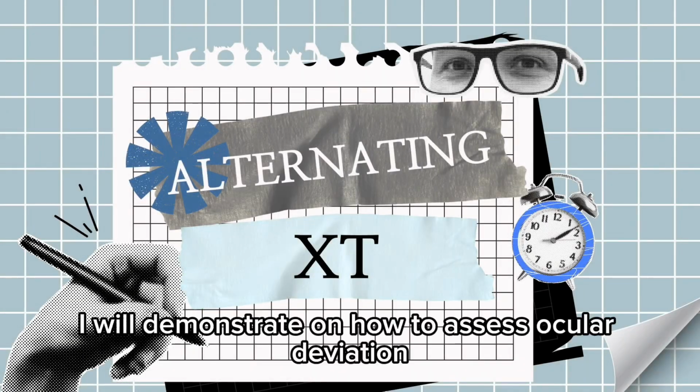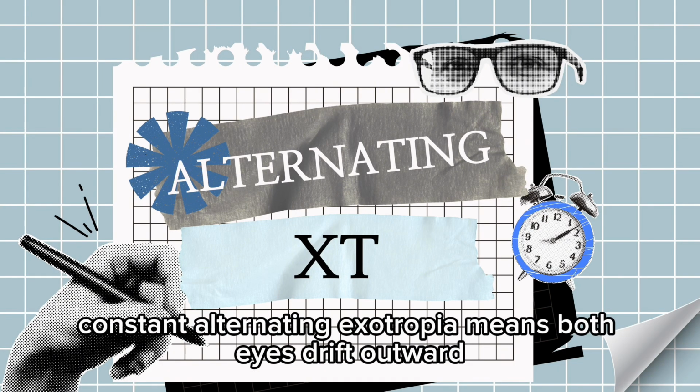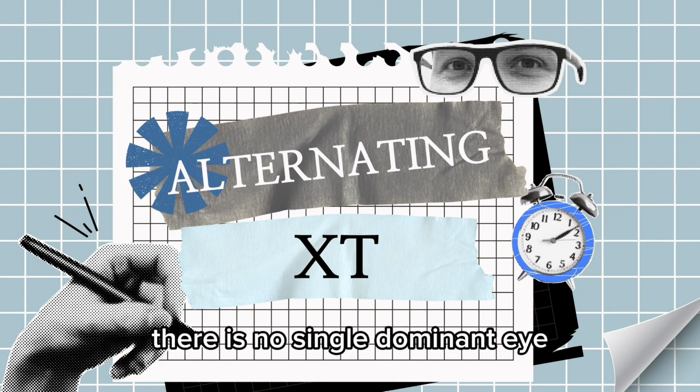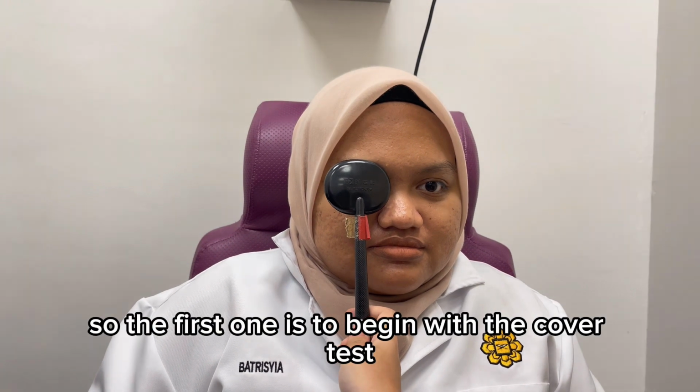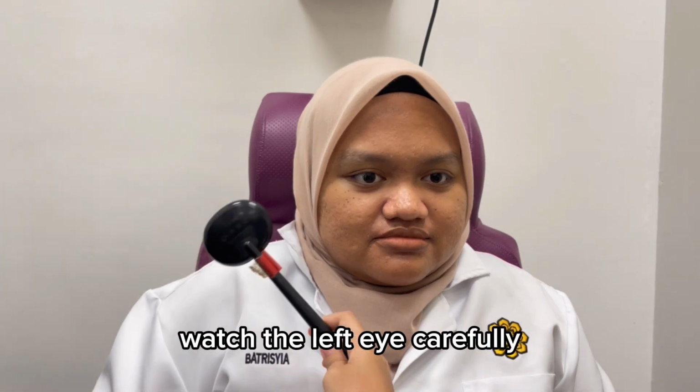So now, I will demonstrate how to assess ocular deviation using the cover test, focusing on constant alternating exotropia. Constant alternating exotropia means both eyes drift outward and either eye can take up fixation. There is no single dominant eye. So the first step is to begin with the cover test. Place the occluder over the right eye. Watch the left eye carefully.